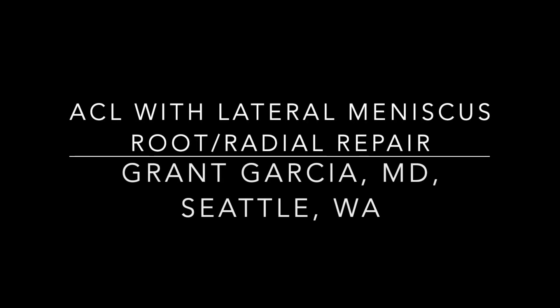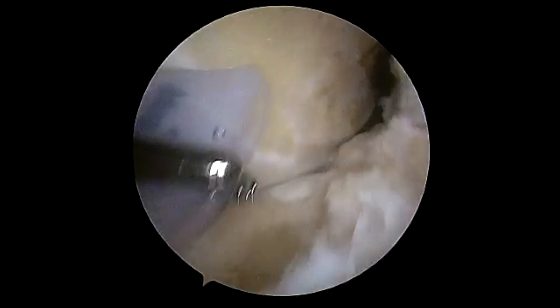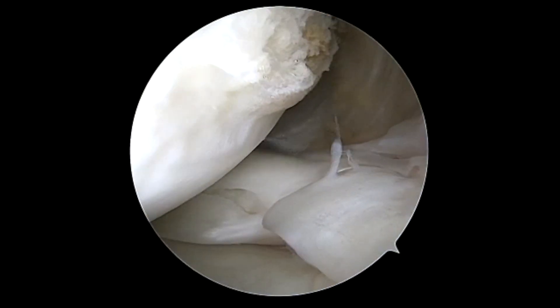Today we're going to demonstrate our technique for a lateral meniscal root slash radial repair with an ACL reconstruction. In this patient, it was a patient under 20 years old with a near acute radial tear. We attempted to repair as best as possible to give this patient the best chance.